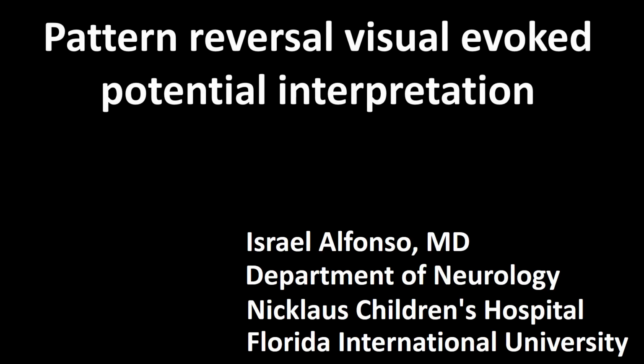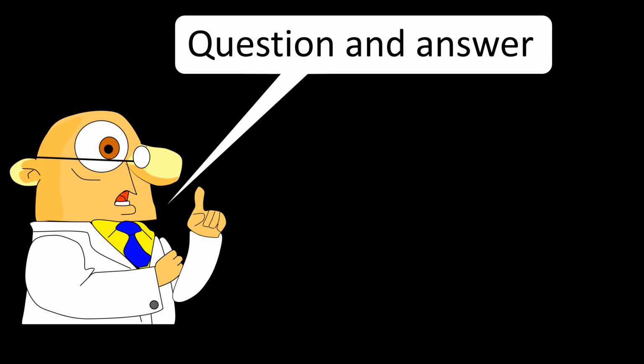This talk is about pattern reversal visual evoked potential interpretation. It is intended for the clinical neurophysiology fellows at Nicklaus Children's Hospital. This talk will be conducted in a question and answer format.